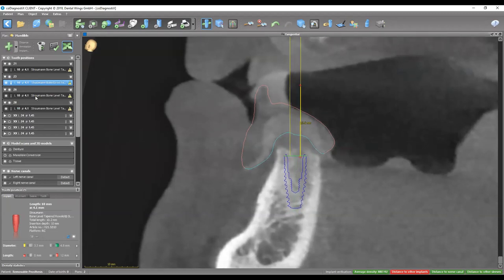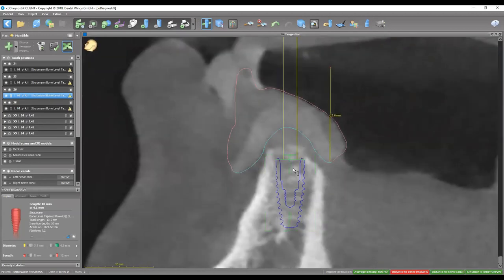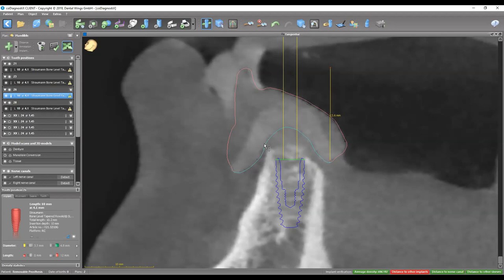Moving on to number 26 — again, a 4.1 by 10. Looks really good. And you've noticed that the center of the implant is also emerging out of the center of the intaglio, which you can see right here. So those were the two anterior implants.